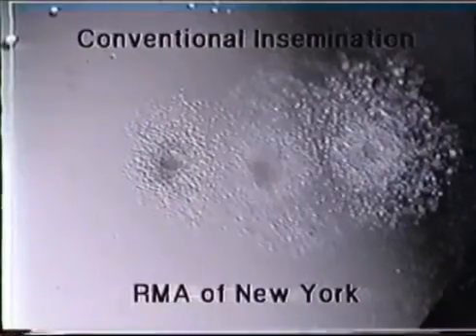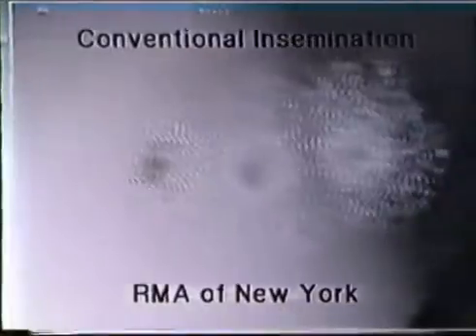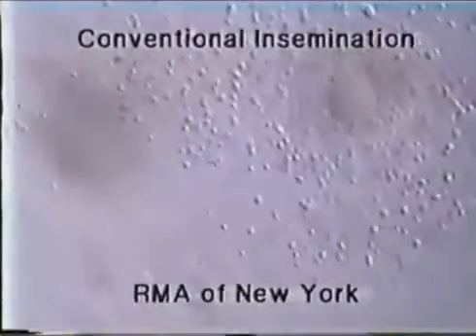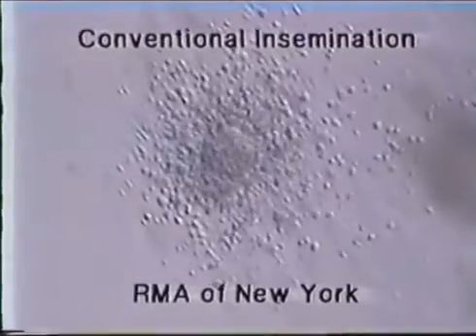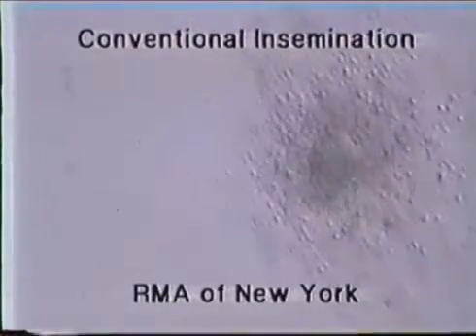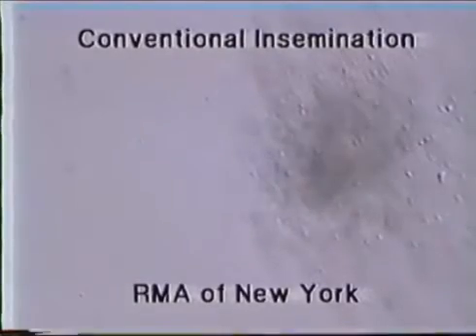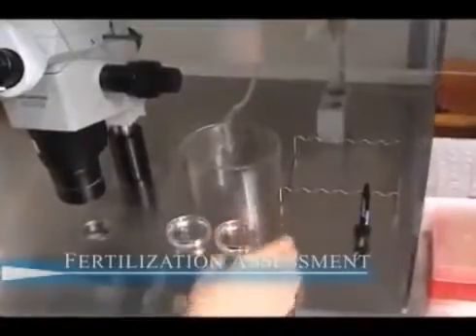Here you can see a drop containing a few of the eggs which were just inseminated and the thousands of sperm swimming around them, each sperm trying to reach an egg. On day 1, fertilization is assessed.